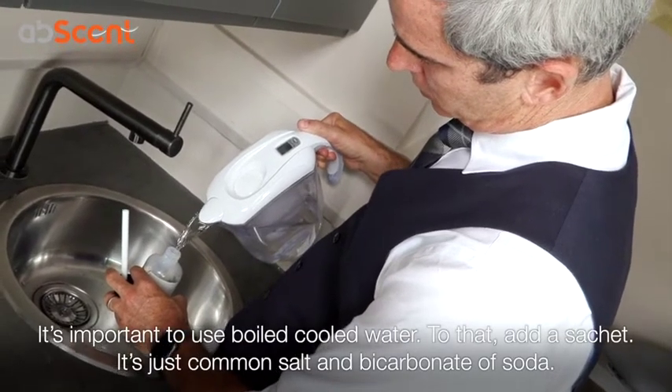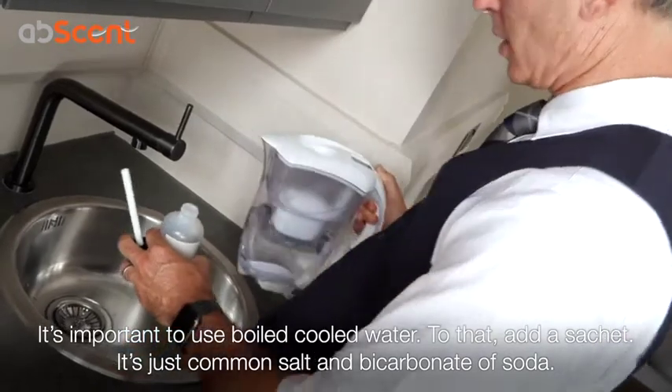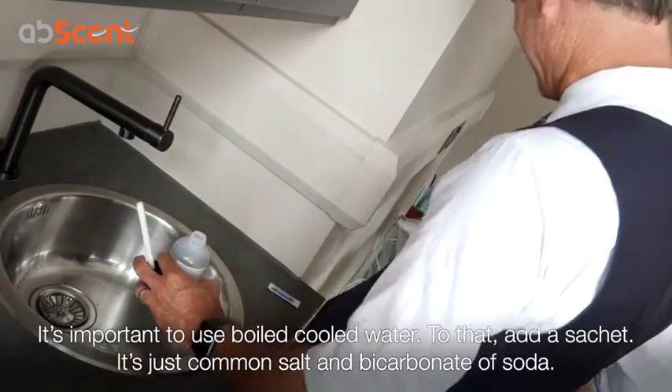It's important to use boiled tap water. So he's now filling his bottle to the line — boiled and cooled. We don't want to scald the inside of your nose.